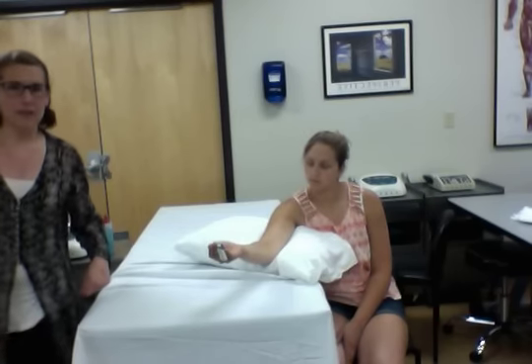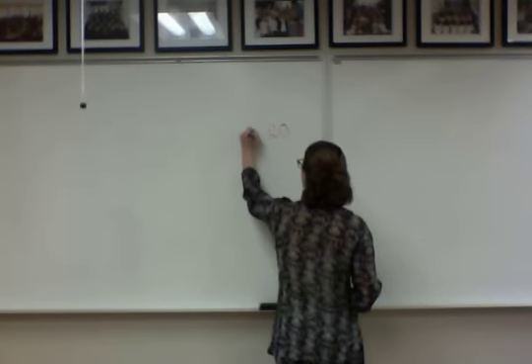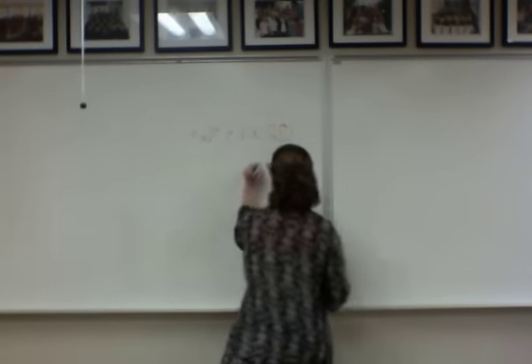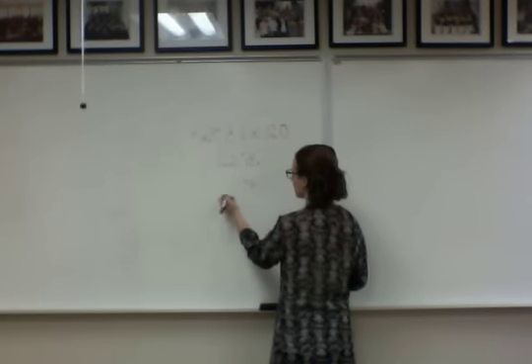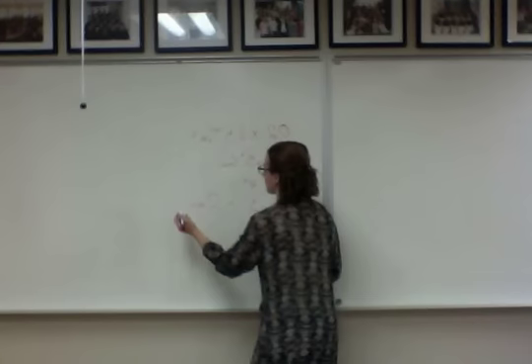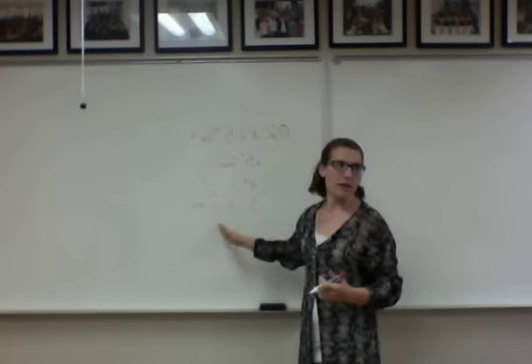1.5. So if I do an intensity of 1.5, let's pivot for a moment and find a marker. Oh, here it is. So if I have 1 megahertz, that means we get 0.2 degrees per minute times 1.5 watts per centimeter squared is going to give me 0.3 degrees per minute. And my goal is to increase tissue extensibility. So I want a total tissue temperature rise of 4 degrees. And if I divide 4 degrees by 0.3, that gives me, I believe, about a 12-minute treatment time. So I could potentially bump this up and do, say, 1.7, which would give me closer to that 10-minute treatment time. So anywhere in this range would be appropriate.